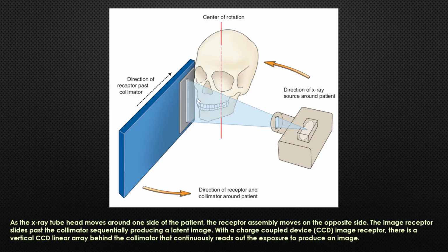If you do that at the exact same rate that the teeth are going to be passing across, the teeth are going to be in focus. What about structures on this side? Because it's got to pass through all those structures, but those are moving the opposite direction and they get blurred.